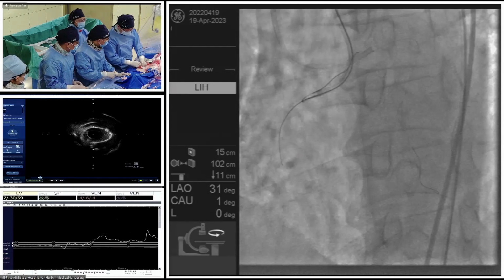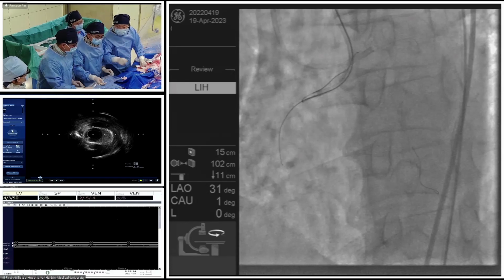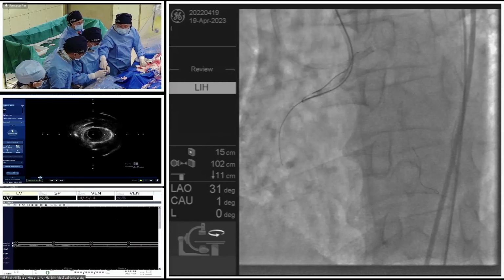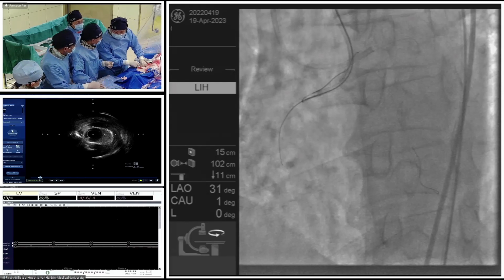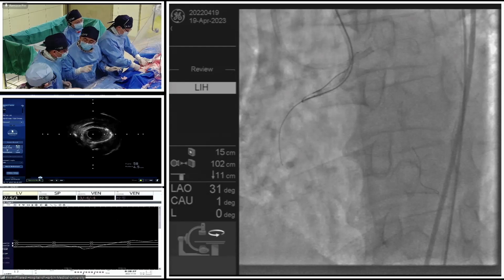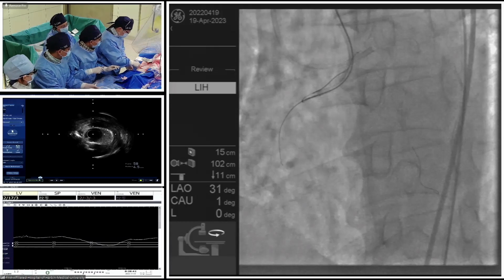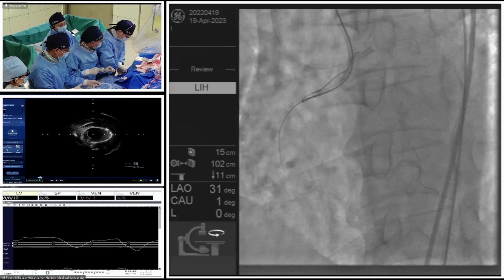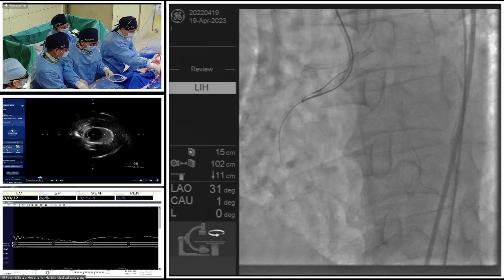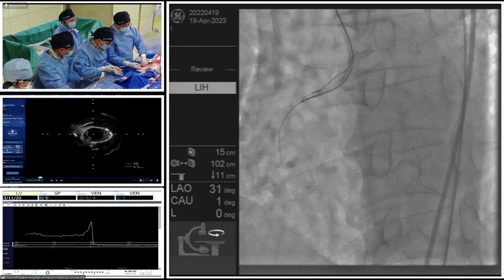Actually for me, whenever I meet a case like this second-hand case, I like to summarize some previous failing predictors. Like in this one, on the previous PCI, the operator didn't perform bilateral angiography, which is a very sad point, because without bilateral angiography, it is hard to confirm the occlusion segment length and detailed information. And also, this kind of blind puncture from the antegrade is gambling and risky, especially like this one.